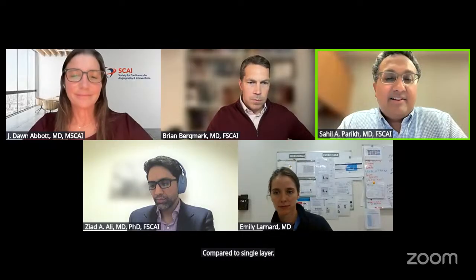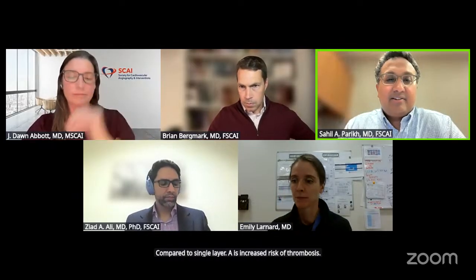Question: what is the key challenge in treating double layer ISR compared to single layer? A is increased risk of thrombosis, B higher likelihood of target lesion restenosis, C greater difficulty in achieving optimal lesion prep, or D reduced effectiveness of DCB.